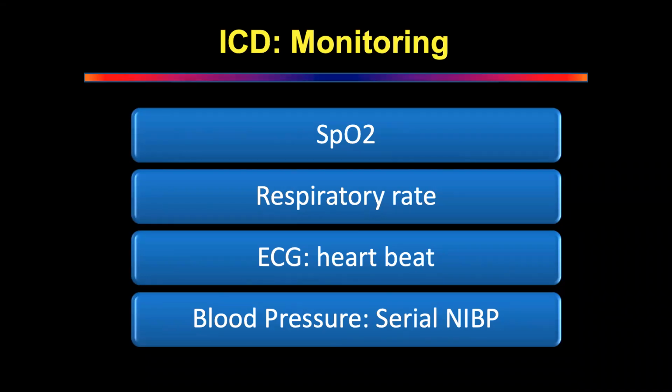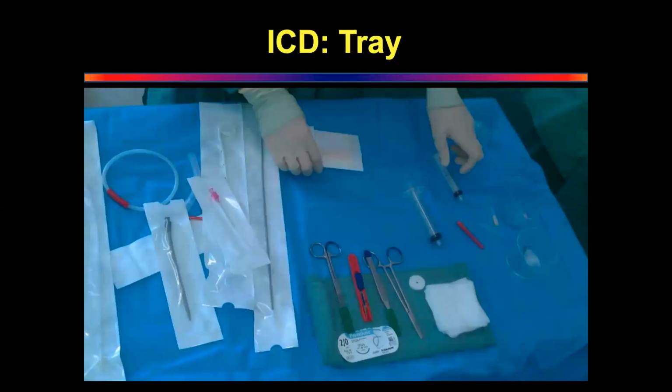That's why I want to make sure that we talk about it and you have a visual image of what is needed. Okay, ICD tray, we know everything. You should be able to identify every single structure on this tray. It is absolutely mandatory. If you don't identify something, I will be very upset. What is this? Guide wire. Fitun, come in. Somebody come in.